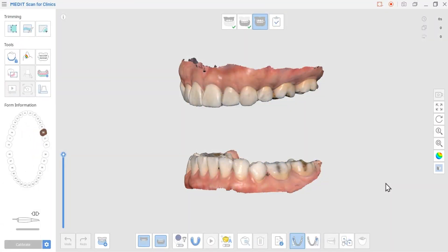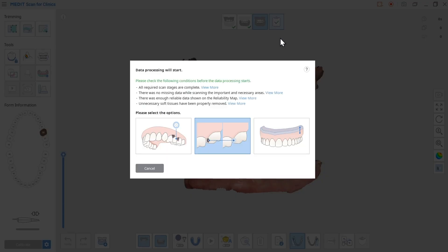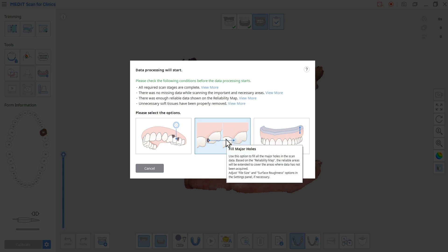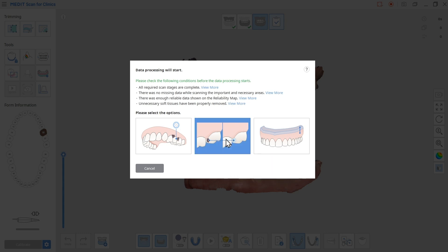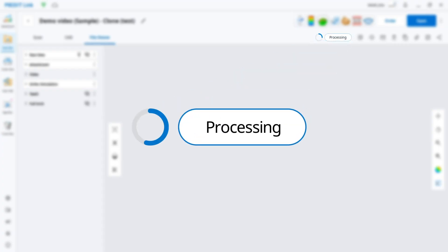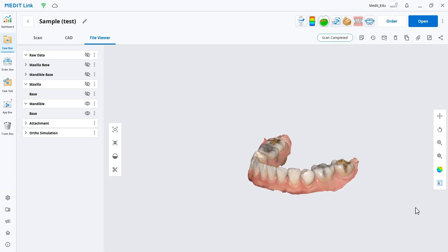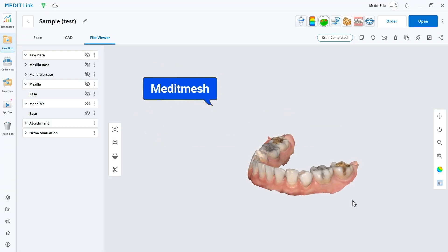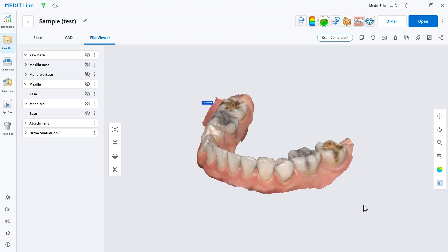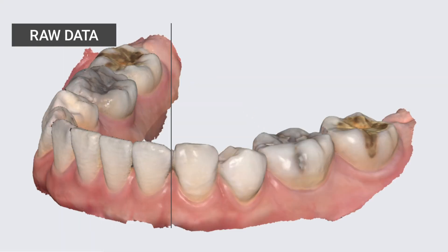Let's first take a look at raw data. Once you scan a case, raw data is created and enters a processing stage. In this stage, the software clears noises and optimizes the data. This processed data becomes what we call MeditMesh data.